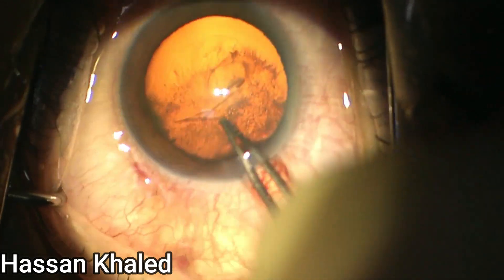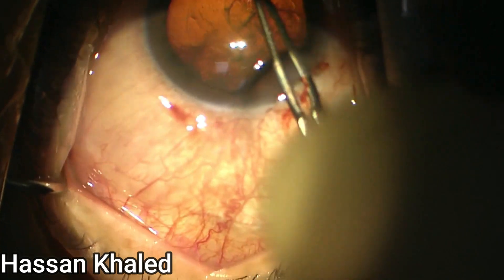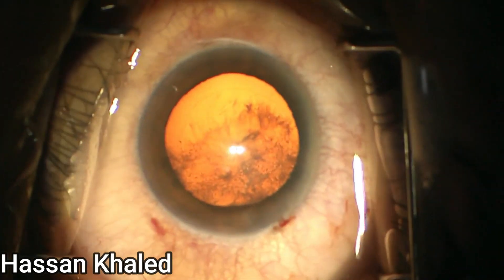Then I started with rhexis. You can see here the rhexis using the forceps, which is about 5.5mm in diameter.